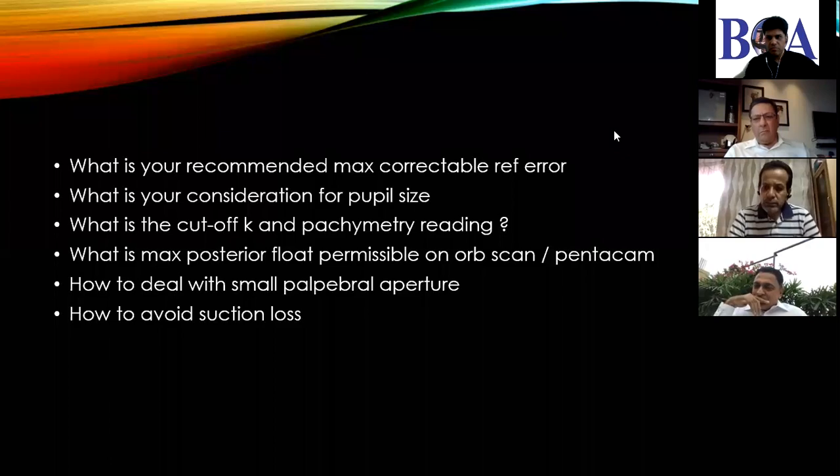How do you get your pupil size, Himanshu? Yeah, as he said, you have the pupillometer with which you can. Which on your machine, how do you get it? Yes. So with switching off the light and then taking the size of the pupil. On your topo? Yes, on my Cirrus machine.